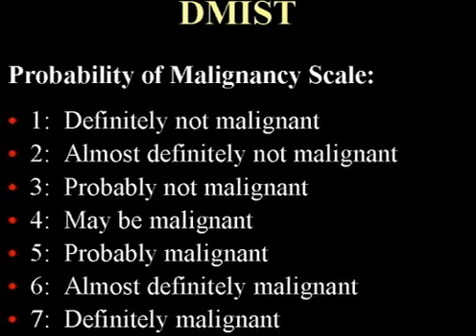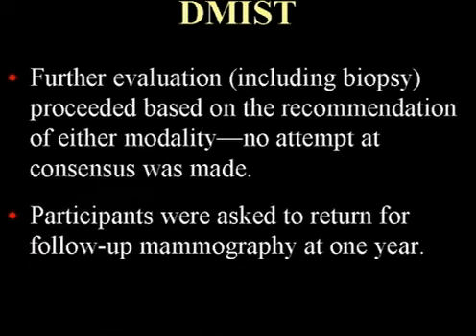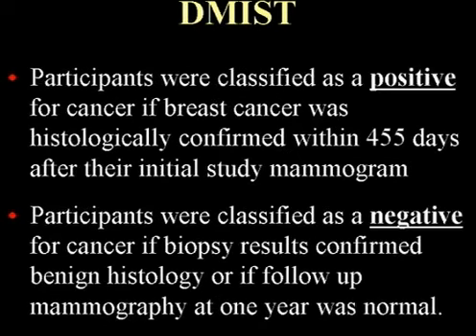And the readers were all trained, but the training really consisted of 'tell me where you think the lesion lies on this scale.' The authors of the paper recognize and admit that the scale has never been validated. Further evaluation of any of the women proceeded on the basis of a recommendation generated by either modality, and the participants were asked to return for follow-up mammography in a year.